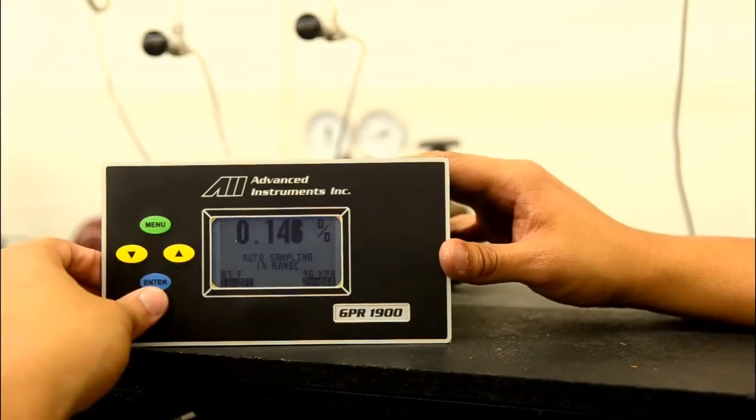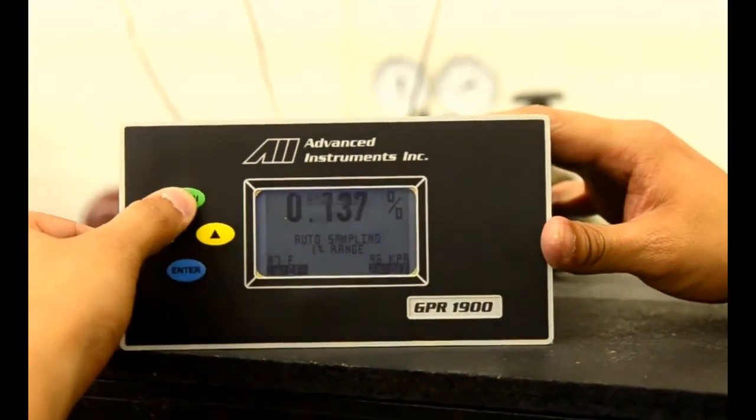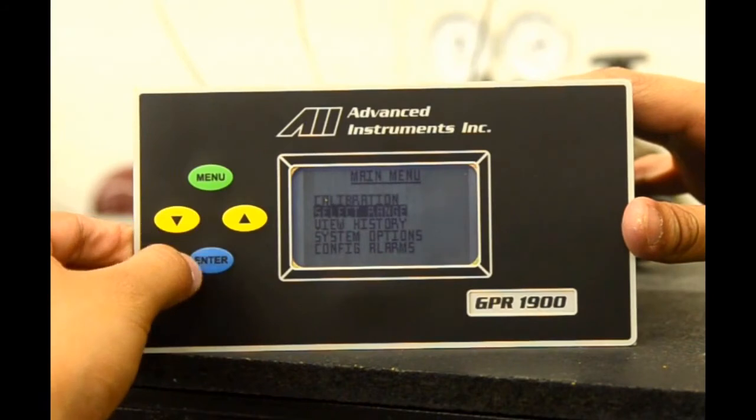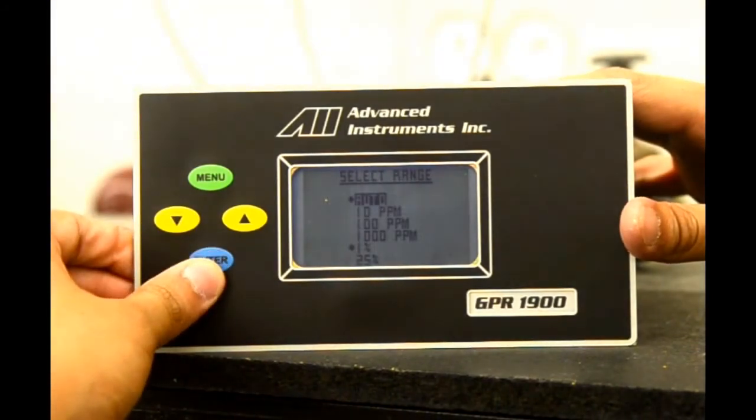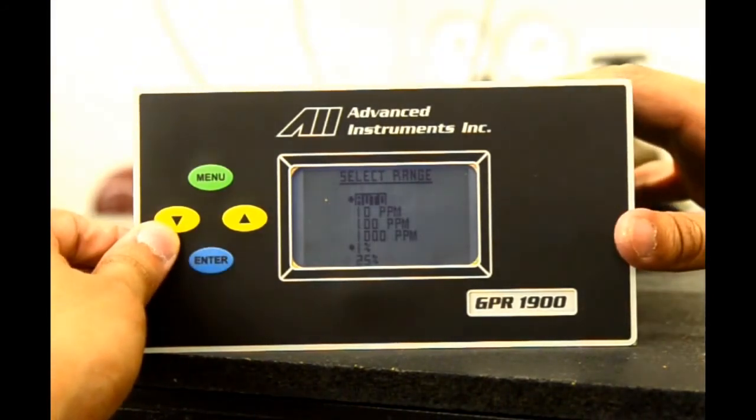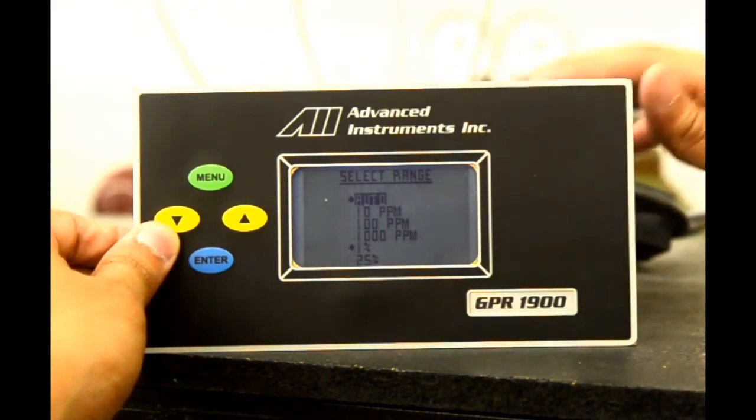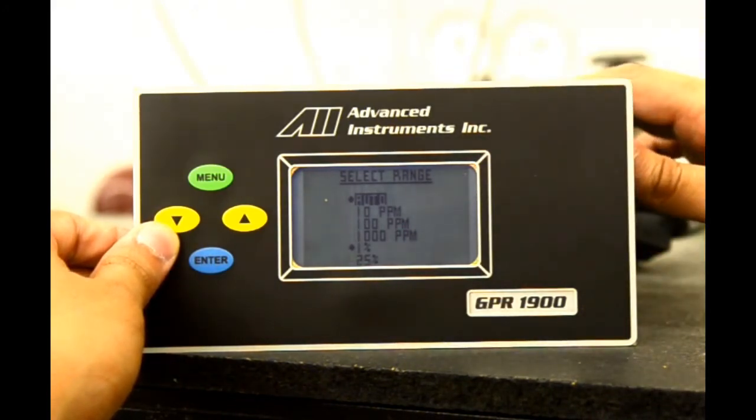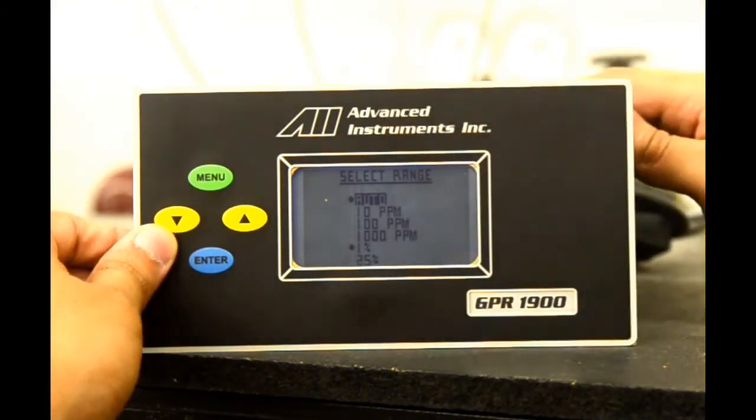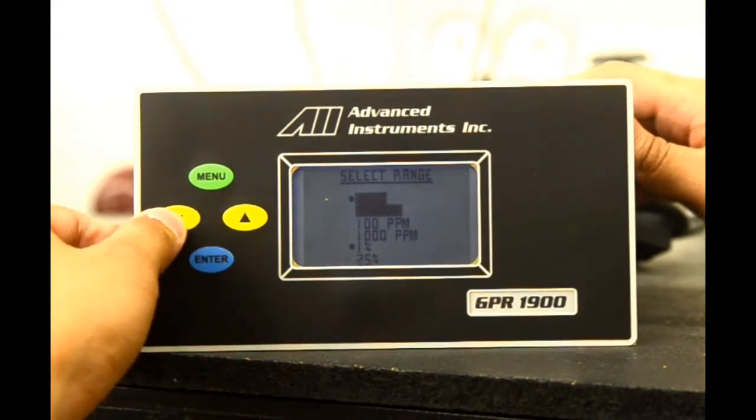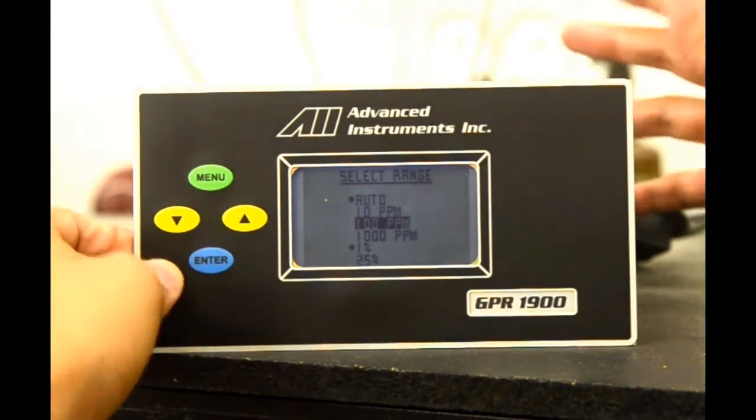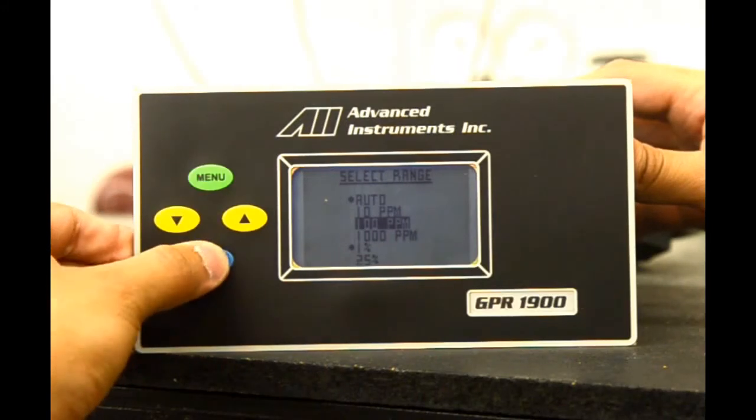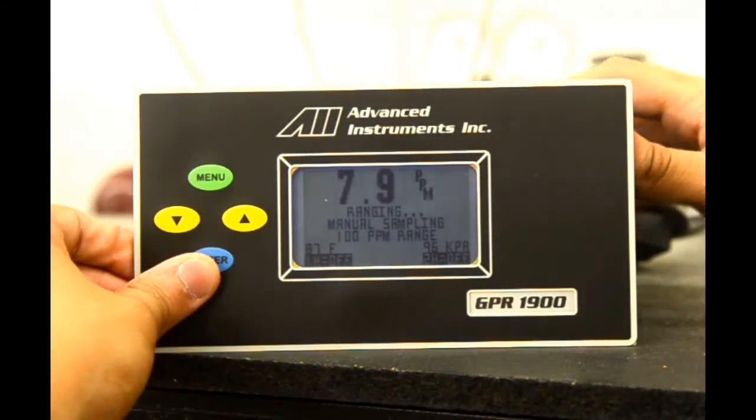We will now go with the select range option. Hit menu, scroll down to select range and select enter. As you can see, currently it is in auto ranging at 1%. This is indicated by the two dots along auto and the 1% range. We will scroll down and select 100 parts per million. This will lock the range at 100 parts, manual sampling. We select enter and as you can see on the main screen, it is under manual sampling at 100 parts per million.